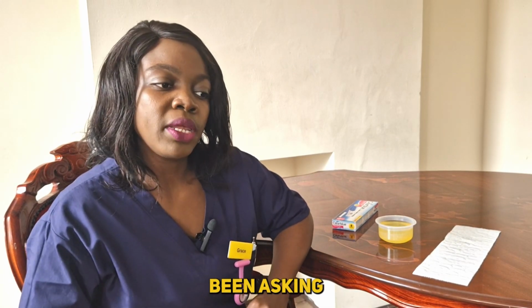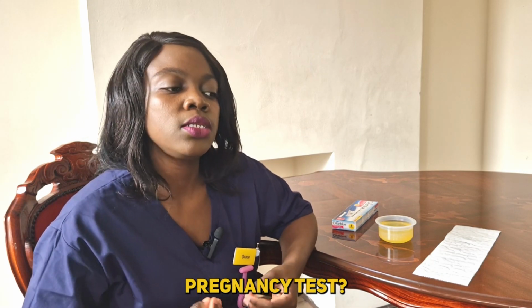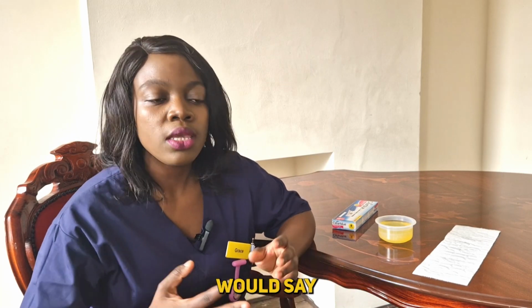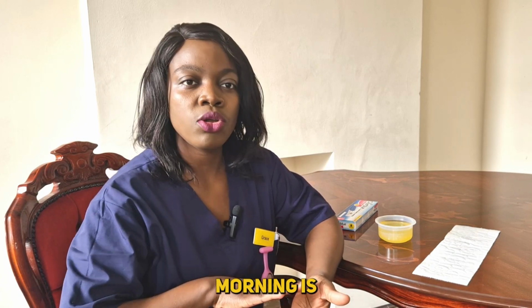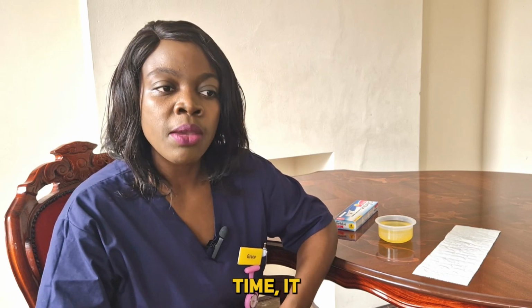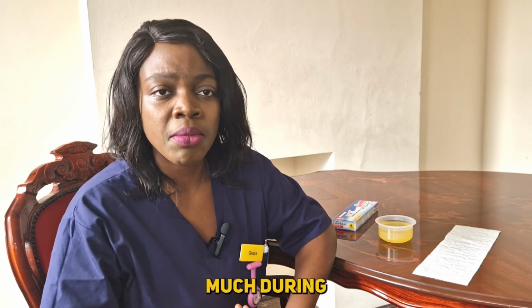People have also been asking me what is the best time for you to do a pregnancy test. The best time, I would say, is early in the morning. Why is it early in the morning? During the morning hours, or during the nighttime towards the morning, is when HCG is most produced in our bodies. And also at that time, it means that you have been sleeping the whole night. When you have been sleeping, you haven't been drinking much during the night.